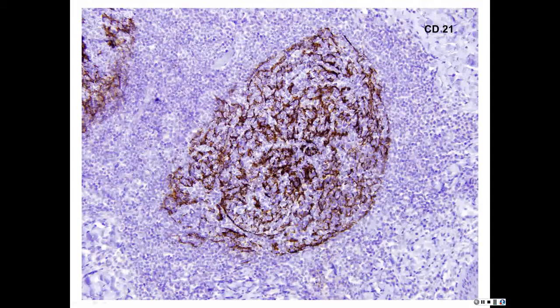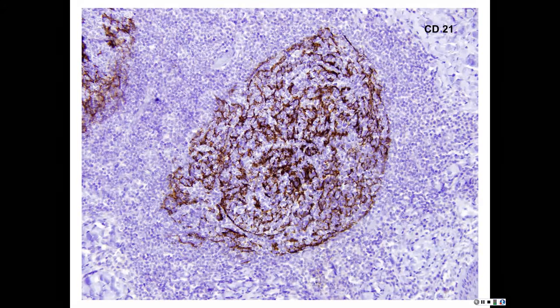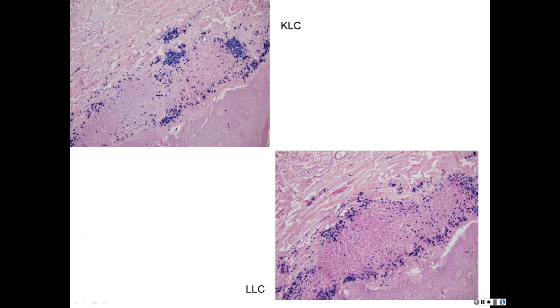CD21 and CD23 stain the dendritic network of the follicle — that's normal. In lymphoma, that dendritic network gets picked apart; there are big holes punched in that net. What you're looking at here is totally normal — that's what normal should look like. Kappa light chain — there are normally twice as many kappas as lambdas. Two-to-one ratio. That's normal.